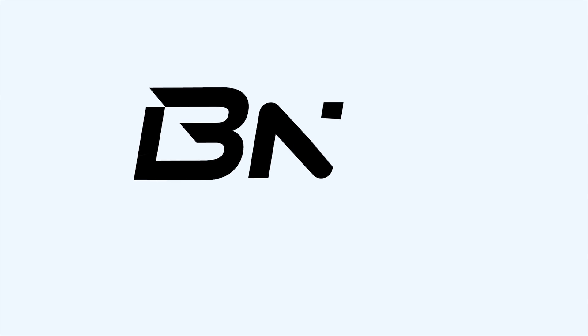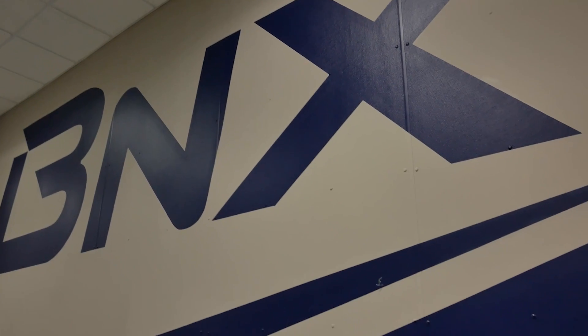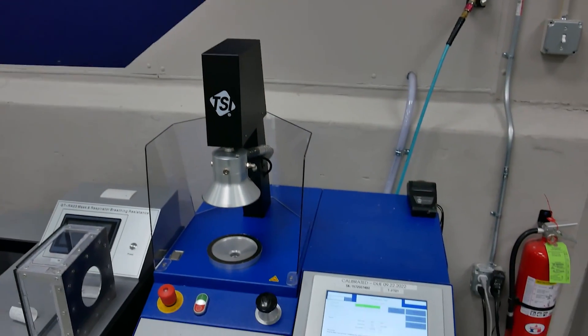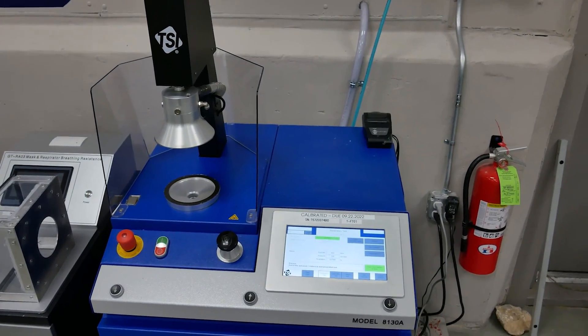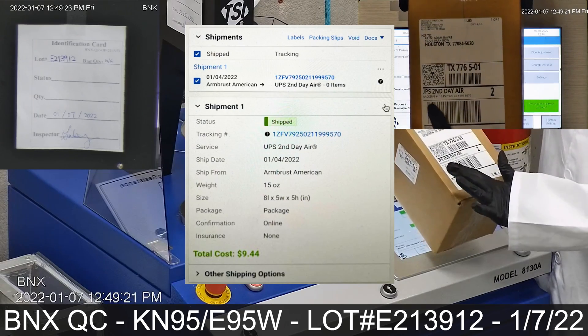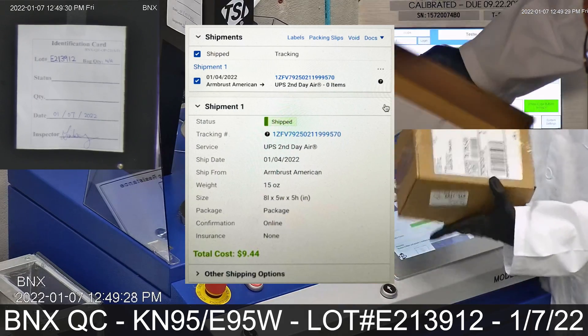BNX is committed to quality control excellence and transparency. In this video we will be testing the direct samples received from Armbrust live and unedited. This is a package shipped to us with the tracking number as shown — the same tracking number provided to us by Armbrust as shown here.